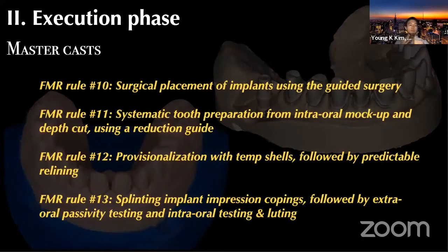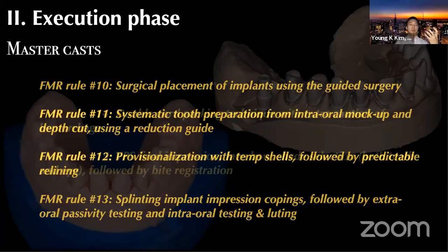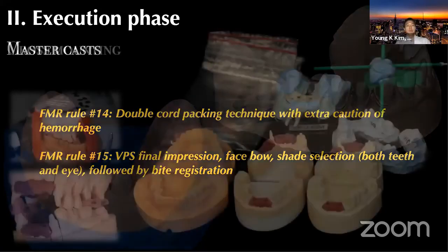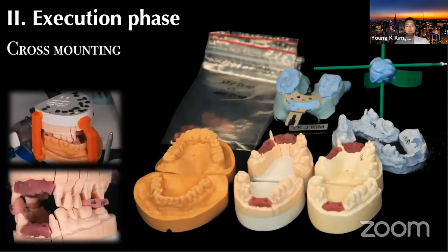As our next rule, number 10: surgical placement of implants using guided surgery and systematic tooth preparation, intraoral mock-up, depth cut using the reduction guide, and proper provisionalization with the temp shells, followed by predictable relining and splinting of implant impression copings with the passivity test, followed by the double cord packing technique with extra caution for hemorrhage, and the final impression, face bow, shade selection and bite registration. So the cross mounting comes after you attain all that information.